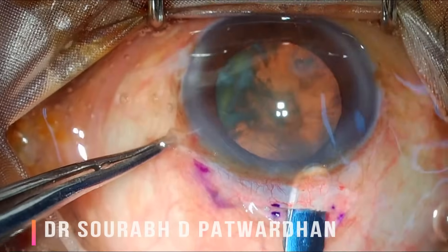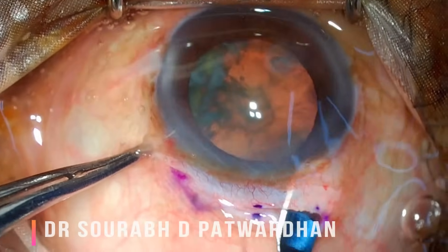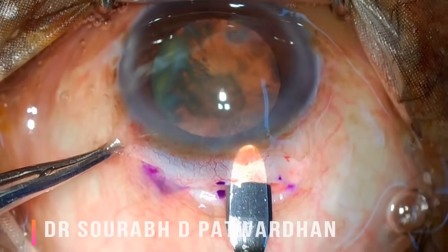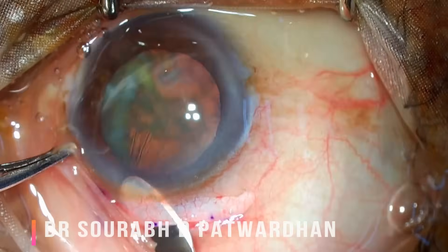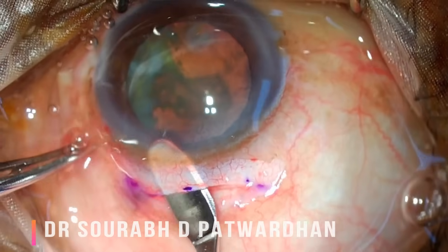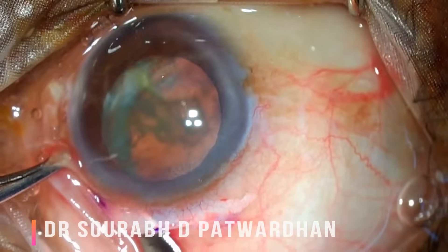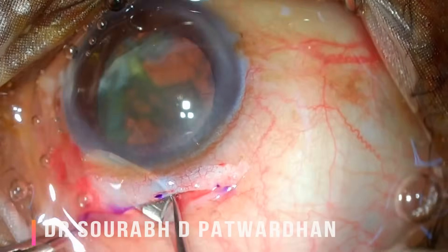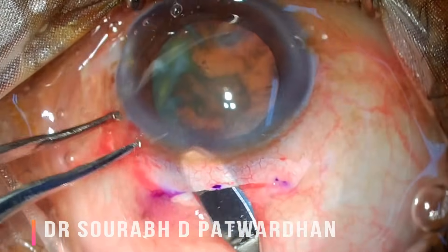Once you reach the right depth, then cross over the limbus. At this point you should make your crescent slightly anterior, so you go into the cornea slightly anteriorly to avoid any premature entry. Watch very closely how I am dissecting the scleral tunnel. I am first going into the cornea because cornea has a good lamellar structure so we can maintain the plane better, and I cut into the sclera while coming out. This avoids a ragged incision which may lead to more astigmatism later.